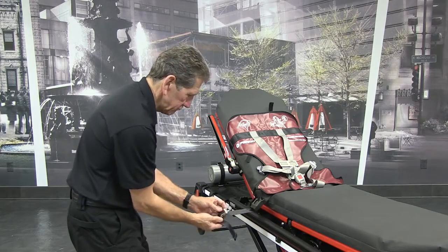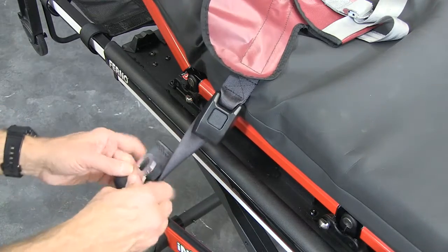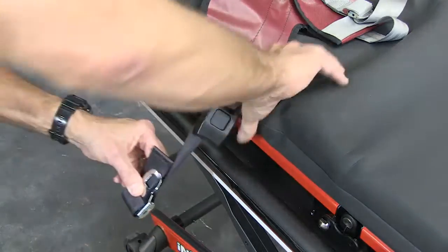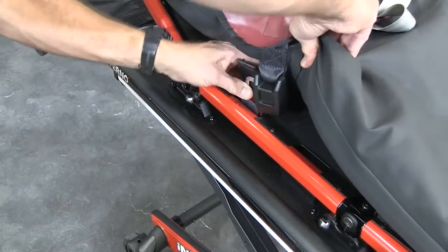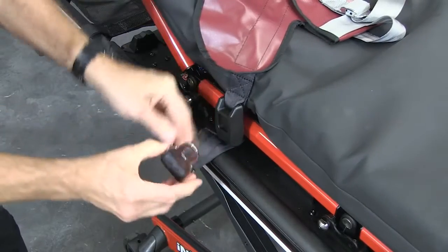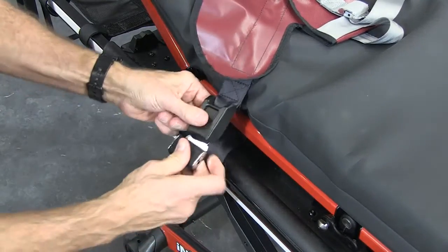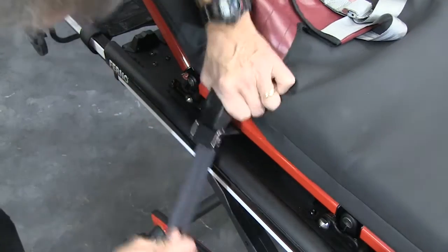Fasten a mainframe strap by threading the tang male end upward with the buckle housing facing the center of the NX, through the slot of the patient surface near the head end of the NX. Wrap the strap around the slot and fasten the buckle. Leave a little slack in the strap for final adjustment.